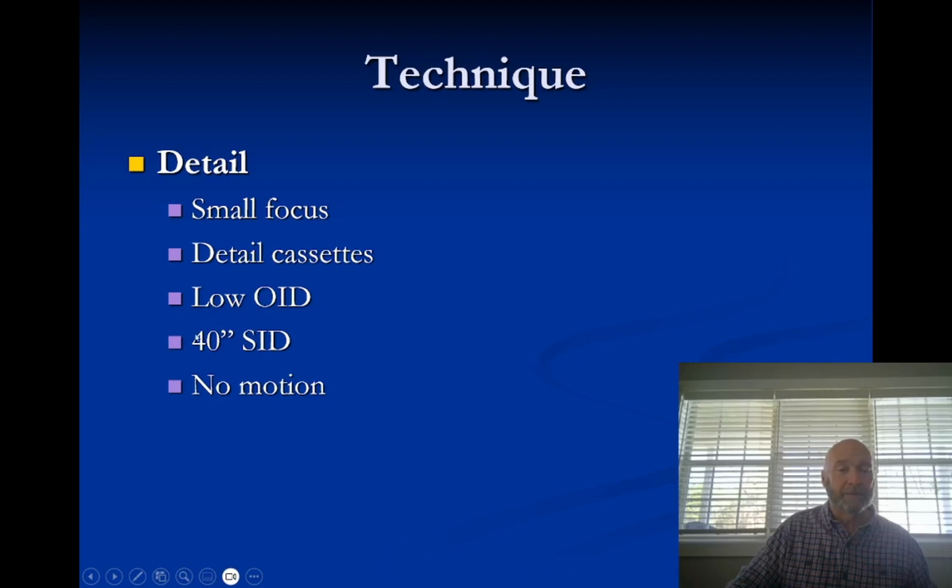and you want to have no motion. Now, something to consider on this 40 inches. Some of your textbooks, including the Martensen, mention 48 inches, and I think there was a push for a while there to get to 48 inches for everything except for what needs to be shot at 72 inches. So 40 inches is the traditional long-time standing SID for most exam types that don't need to be at 72. But that push to 48 inches, I don't think really gained any momentum. So we're still shooting at 40 inches. If you happen to shoot at 48 inches, that's fine.